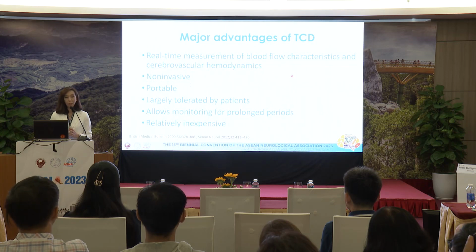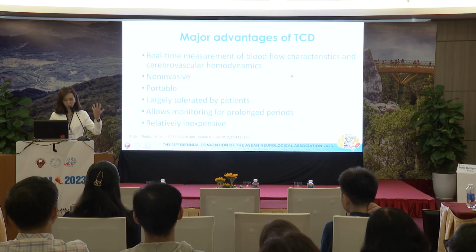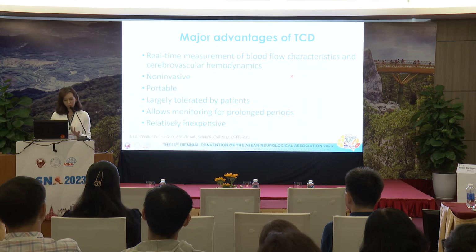So there are advantages of TCD comparing to some other techniques that we use to identify or to diagnose stenosis of the blood vessel. So it can be done at real time. You can measure the blood flow at real time, so you know exactly how much blood flow is going in, the velocity of blood flow, and the direction of blood flow at the very moment. It's of course not invasive.